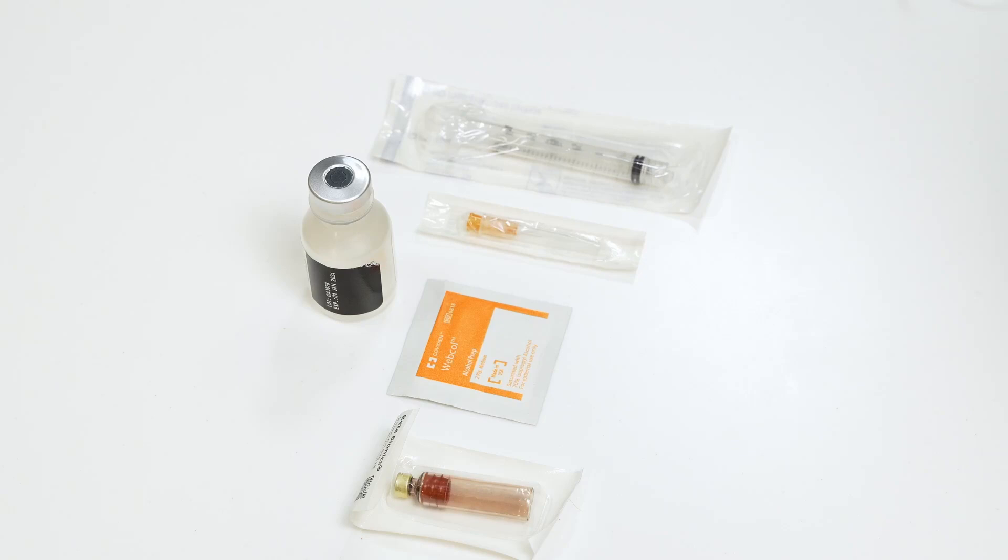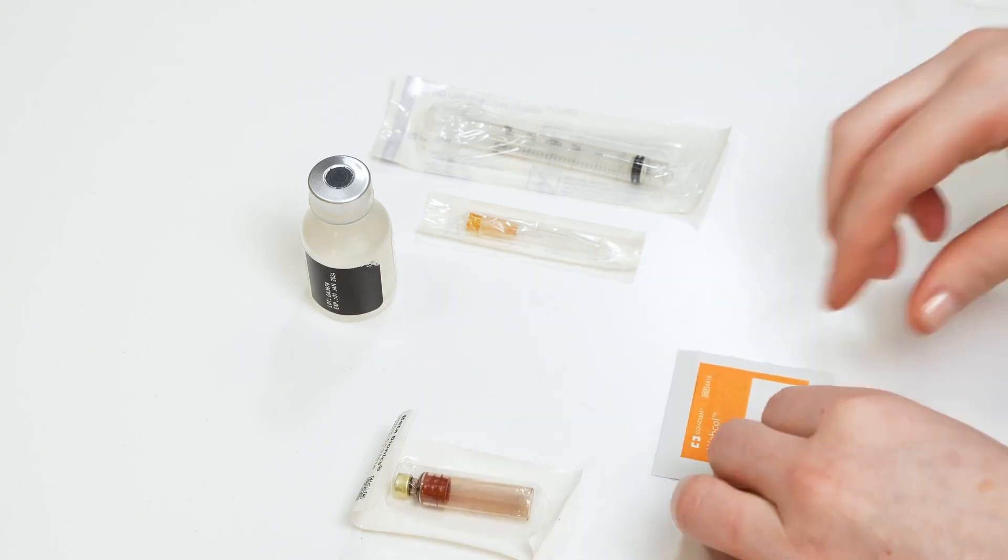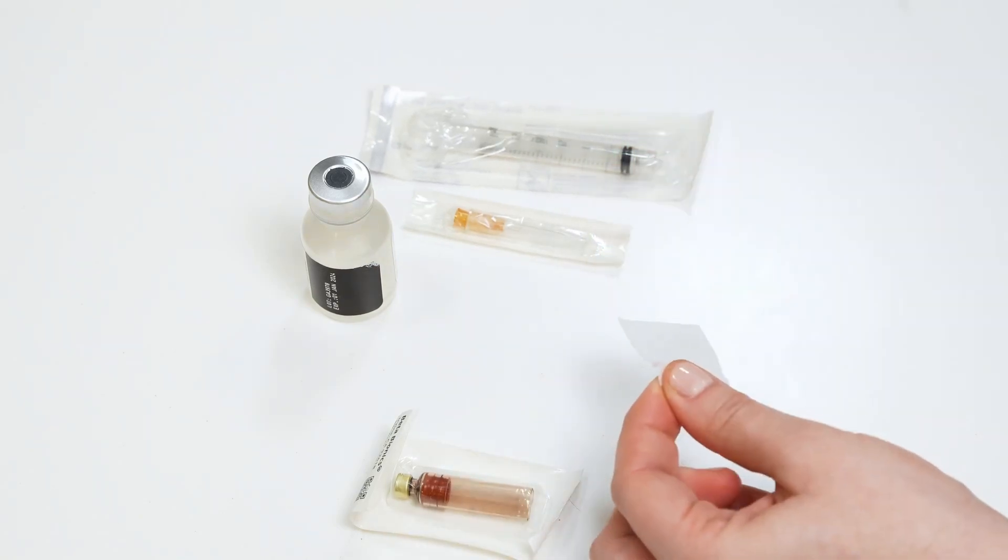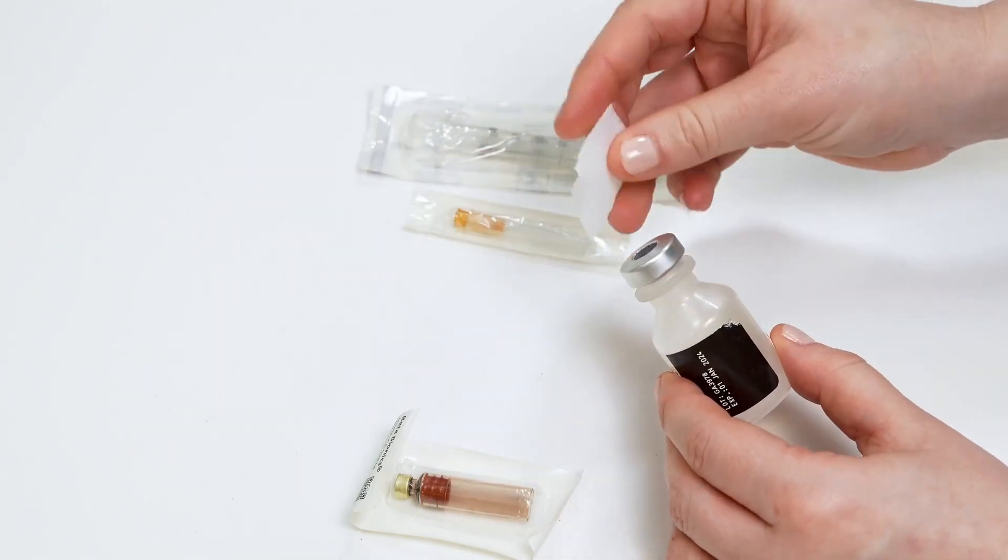Make sure you have the required supplies and a clean work surface to fill the islet cartridge with insulin. Gather the following supplies: an islet cartridge, a syringe and a needle, a vial of Humalog or Novolog insulin, and an alcohol swab.